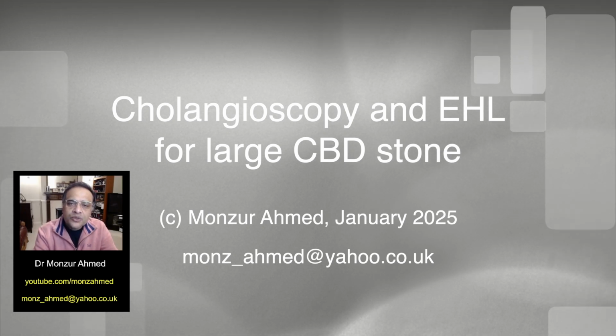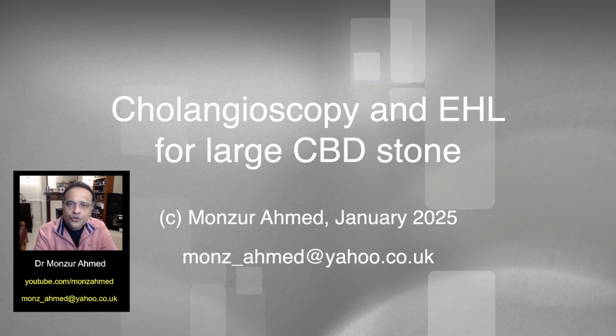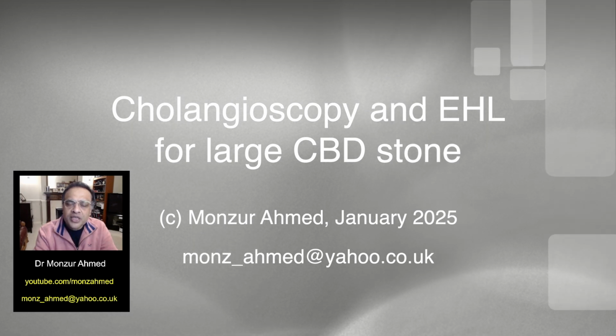Hello everyone, and welcome to another case, this time demonstrating the use of cholangioscopy and electrohydraulic lithotripsy for the management of a large common bile duct stone.